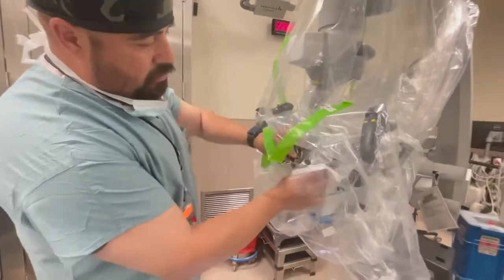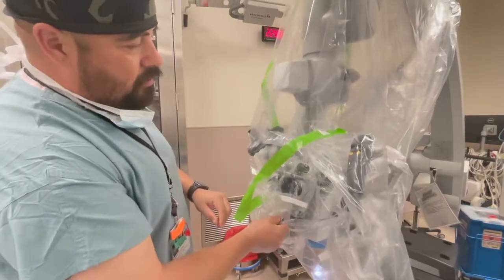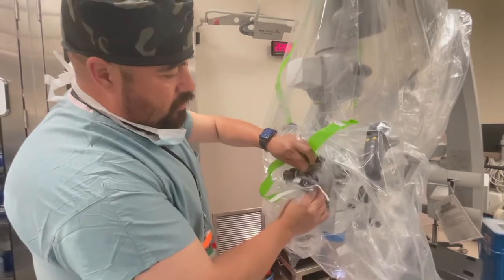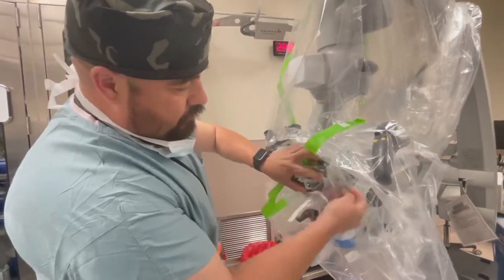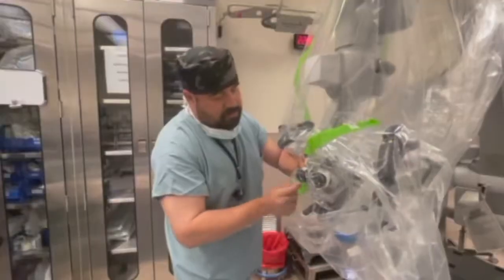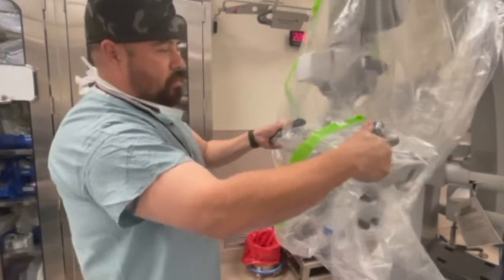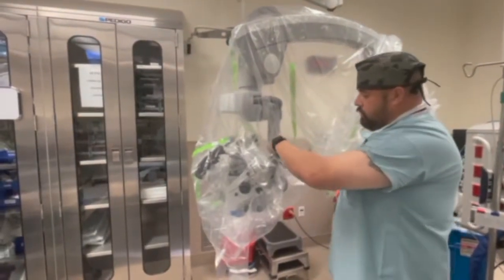This one is a newer microscope. This newer microscope comes with a mouthpiece. The surgeon moves the microscope with his mouthpiece. So just be careful when you're attaching the drape onto this eyepiece. Okay, now that you're done with this side of the eyepiece, you go to the other side. This other side is not as tricky or hard like the other one because it doesn't have a mouth control.